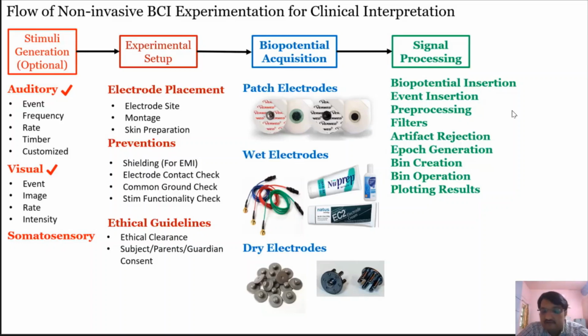There are ways to plot EEG. You can plot it as a function of head location, since there are some landmarks on your head, and wherever there is more activity you can show it in a different color. Another thing, you can show the standard error of the mean. Because we are considering almost 120 epochs in some experiments, you should show that this is the average value, but what is the deviation, in simpler terms the standard deviation, or how it goes up and down from the averaged value.